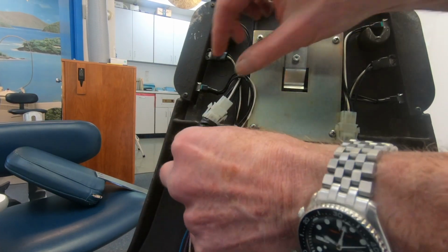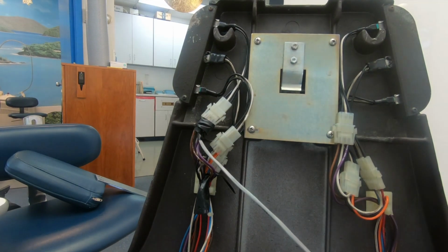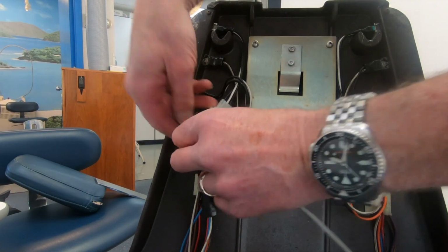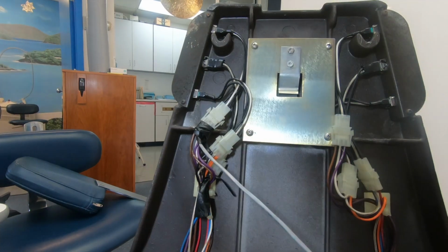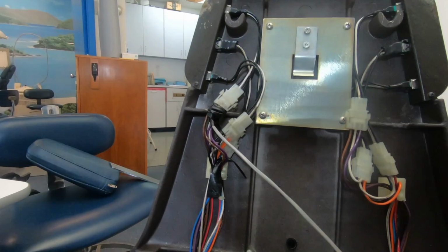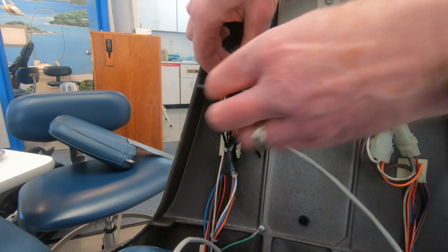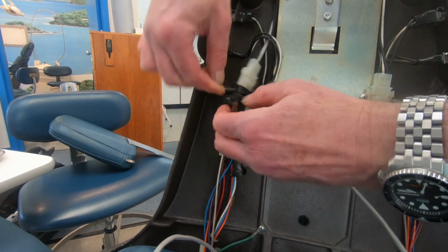So at the other end of the chair, there's a wiring diagram, and it shows that the brown wire, both on that switch and on the foot end of the chair, control the backwards recline of the chair. So that's how I knew which wire it was. And I ran that gray wire from the switch to the board where the brown wire was. I just shoved it in the little opening, and the chair actually worked, and it worked for like a week or two with no issue.